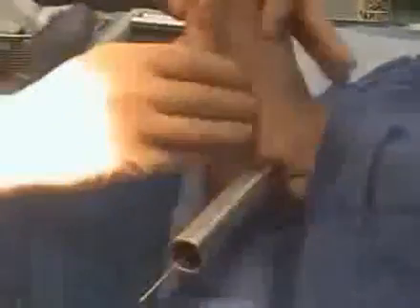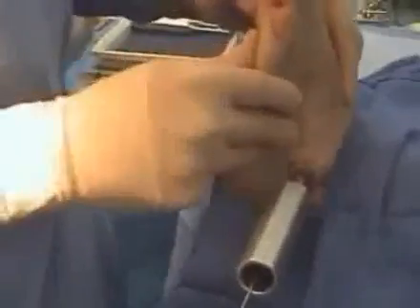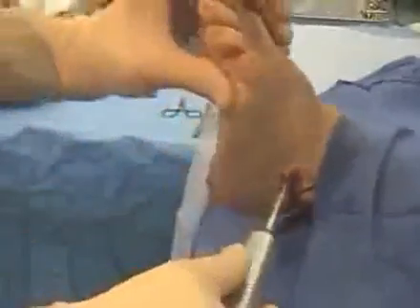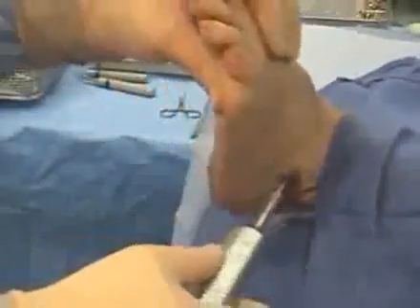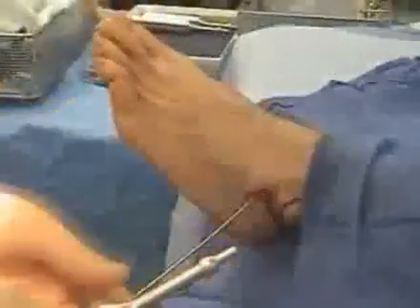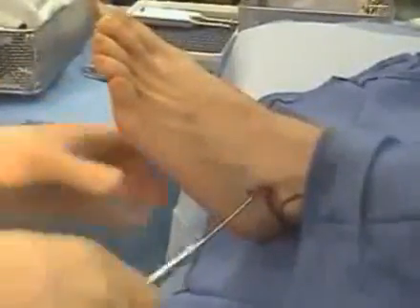Again, I want to show the trial sizing again. You're going to push it in till the sizer just won't go in anymore. And we're going to stabilize the fourth and fifth met heads and just push on the foot as hard as you can. And you'll see how much correction you're going to achieve. The overall goal is, remember, thou shalt not varus. So just as long as we have some pronation, that's okay.